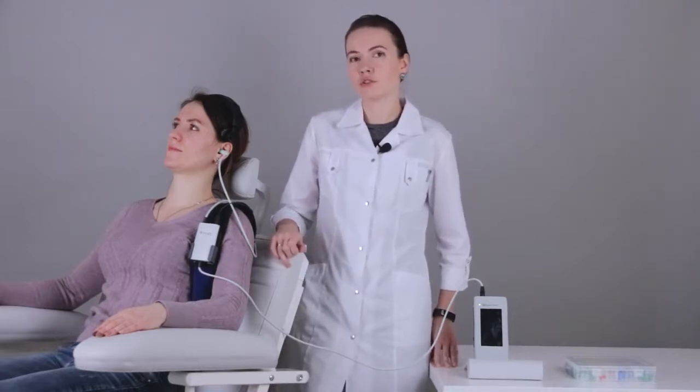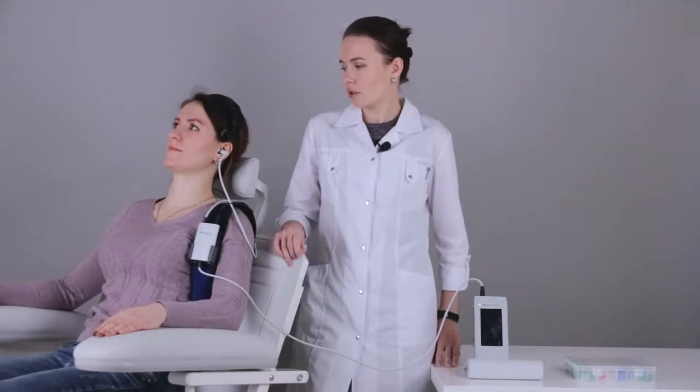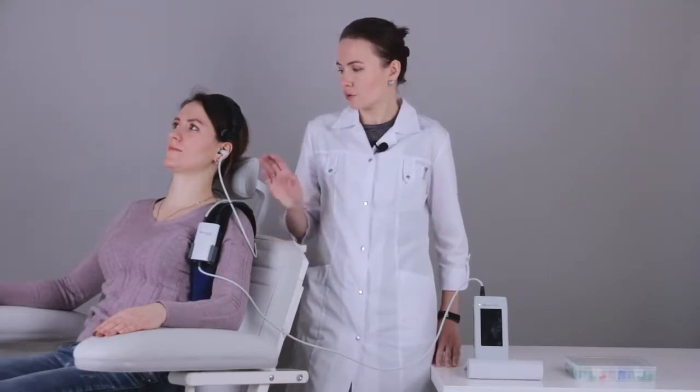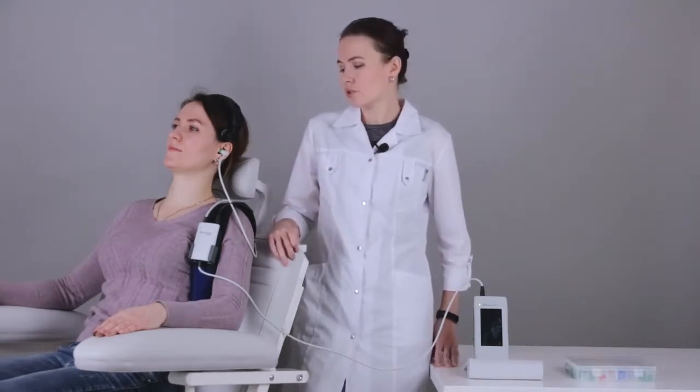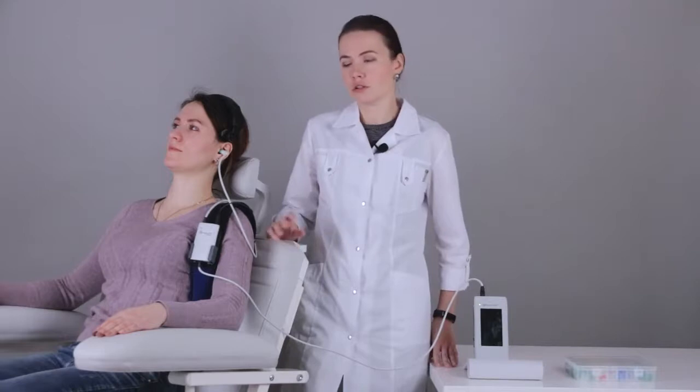During this procedure there will be a loud intensity sound, which will be given using the probe or a contralateral headphone in some cases. So we need to instruct our patient: we ask the patient to stay still, not to swallow, and not to breathe very deeply during this time.